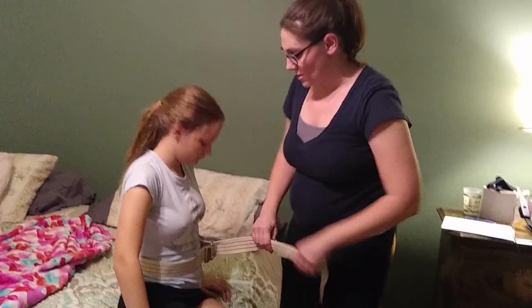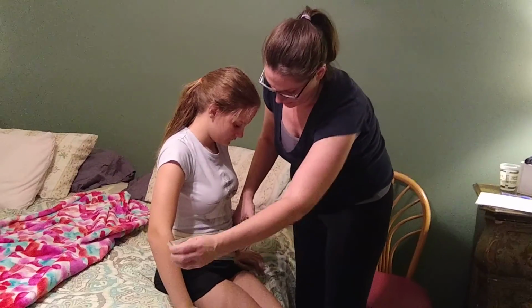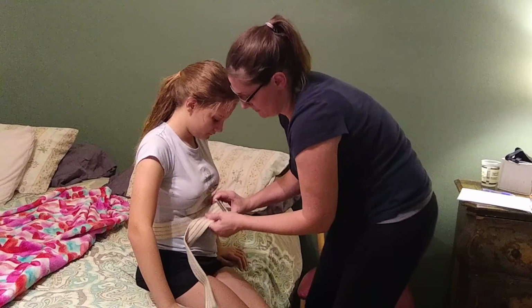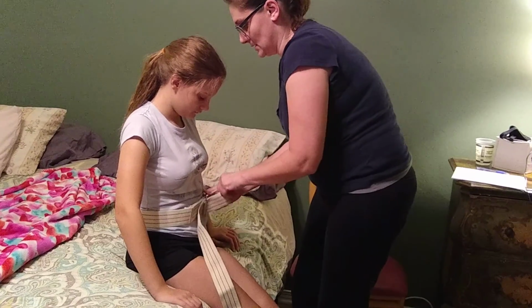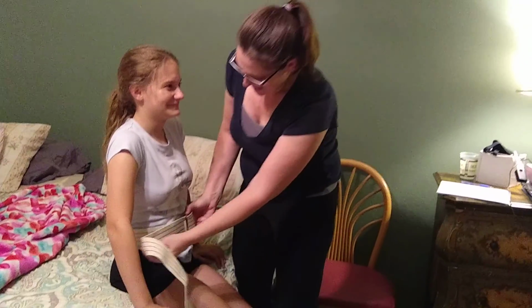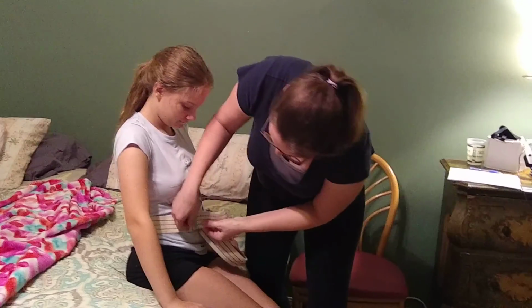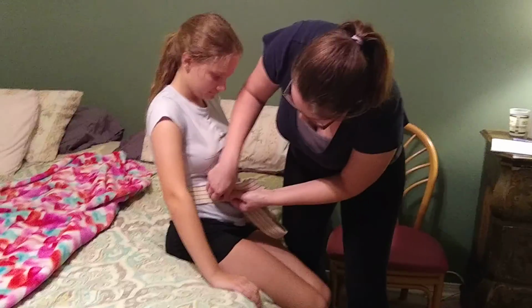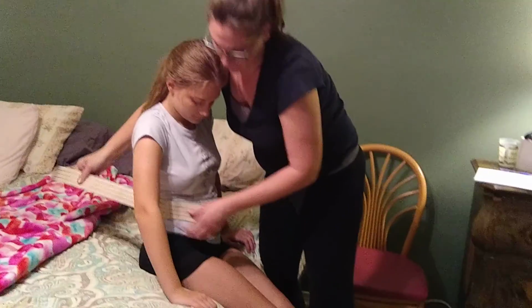When I put the gait belt on, I want to make sure that it is pulled nice and snug so that she doesn't slip out. My volunteer is a very tiny person. So when I'm doing this, I should be able to slide my finger in here, but I shouldn't have any more space than that because we don't want them falling out of the gait belt. So I'm going to make sure that all the slack is tucked in. Again, maintaining those safety precautions and minimizing any fall risks.